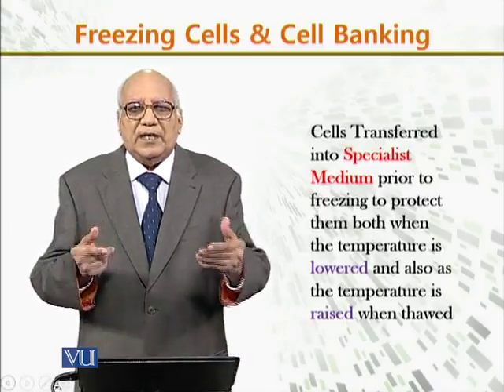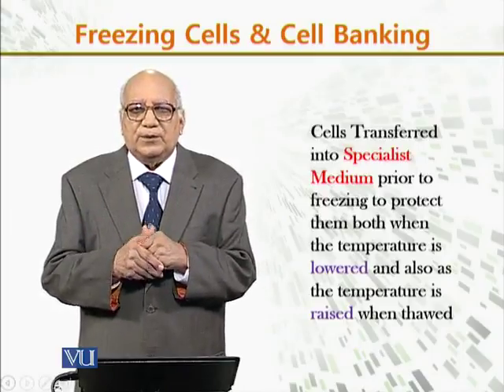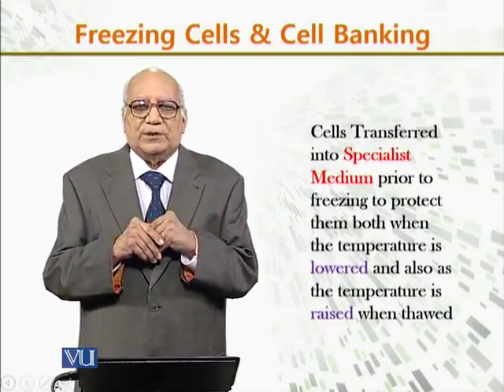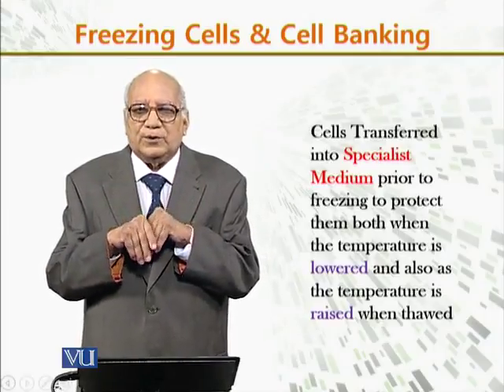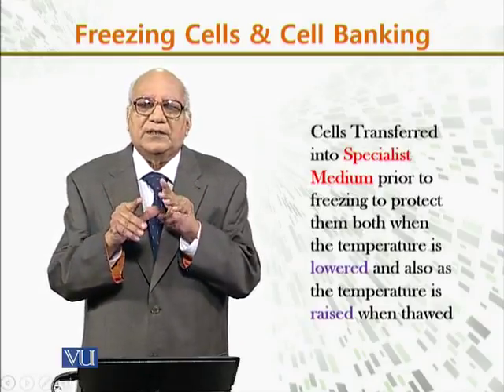Now, the cells are transferred into a specialized medium prior to freezing to protect them both when the temperature is lowered and also when the temperature is raised, that is, when it is thawed.